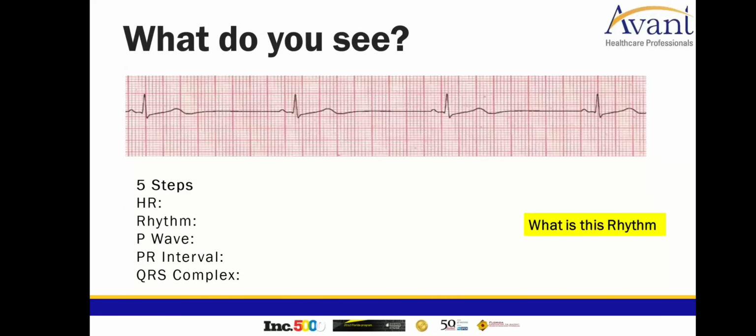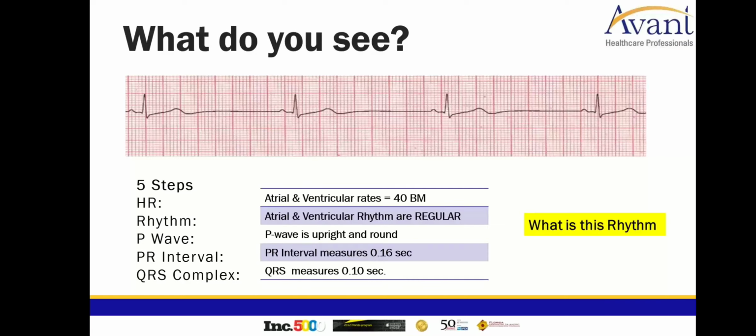Let's go ahead and you start with the heart rate, both atrial and ventricle, the rhythm, P wave, PR interval, and QRS complex. Remember, you can pause the video to give yourself time to do that. All right, let's take a look at what we got.